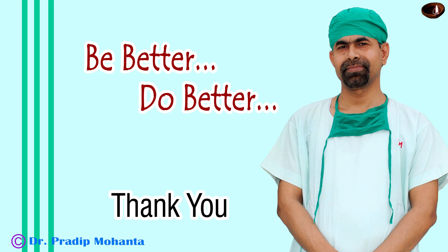Thank you very much for watching. Hope this video will help you in developing your surgical skills.